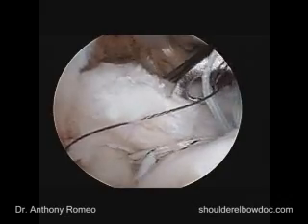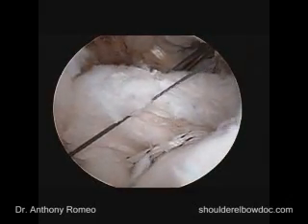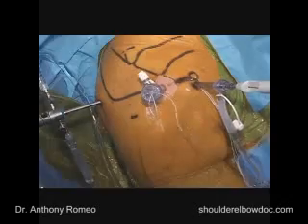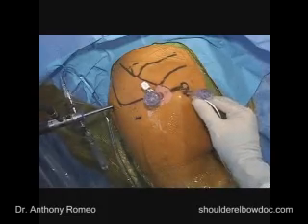Come through with our crochet hook, slide around our wire loop, back to our suture, and then through. Once that's been captured, we can then pass our wire back down and out the front. This will be the last one for this anchor, and then we're going to have to do all these steps over again for one more anchor to set the top part of our repair.